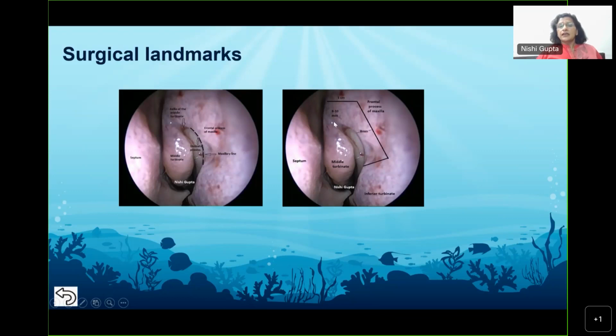If we give an incision here and then we want to expose the sac under the flaps, then sometimes we may be able to do it, but it is cumbersome. So it is better to give the first incision right. If we give the incision at this side, that's the horizontal incision. This continues into the vertical incision, which turns into another horizontal incision just above the superior attachment of the inferior turbinate. The advantage is from the fundus of the sac till the NLD, we can see the complete sac and NLD. No sump syndrome if we expose this portion also. No failure if we marsupialize this part also.